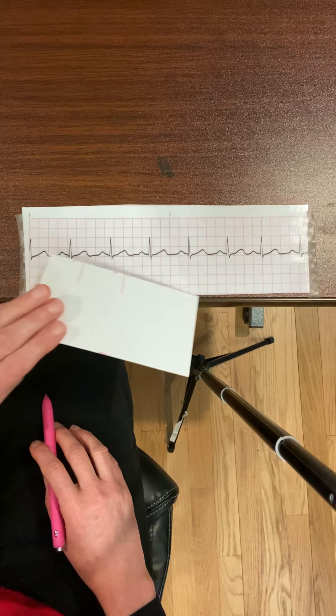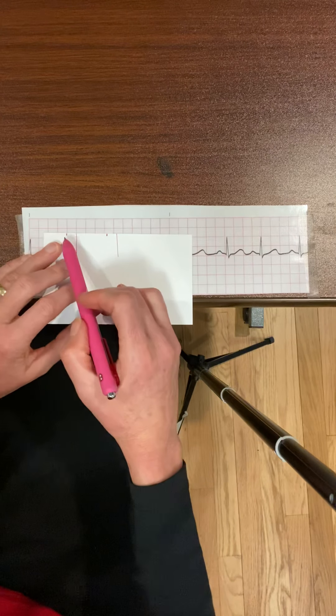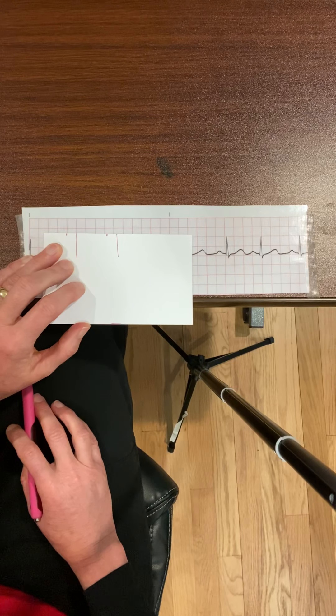To measure the PR interval, take your card and bring it up to a big box. The beginning of the P wave is here and the beginning of the QRS is here — this PR interval is 0.2 seconds, which is within the normal range.